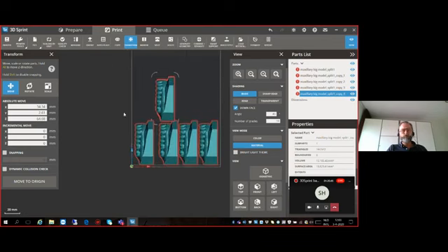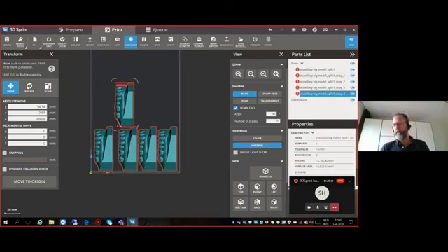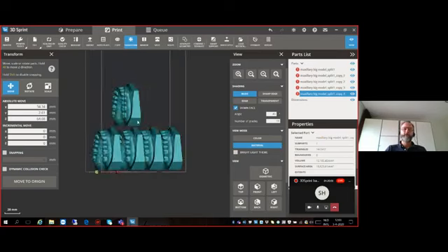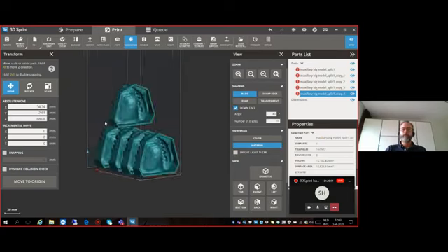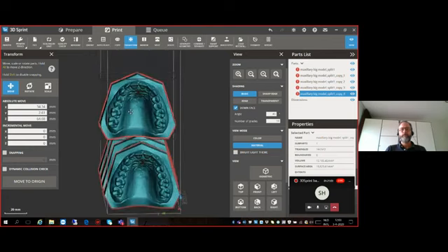Yeah, the maximum so far, I believe, is 40 models. So 40 models already. Okay. Yeah, if they are small, the smaller they are, the more you can fit, of course. And yeah, the print time for a full volume of printing will be approximately 2 hours. So that's very exciting. We're looking forward to handing this over to the broader market.